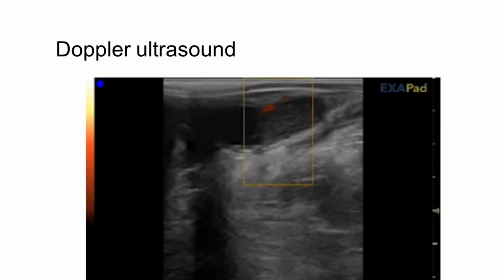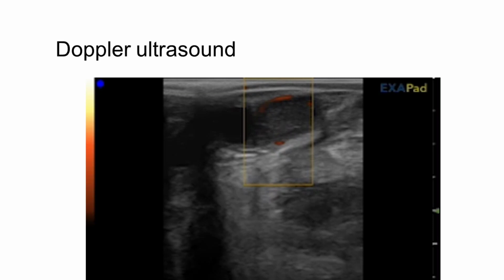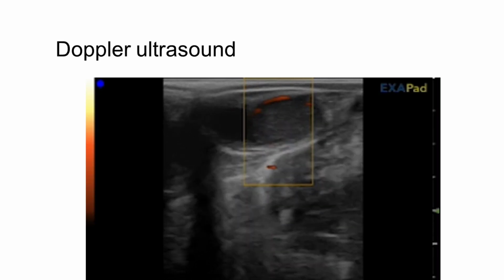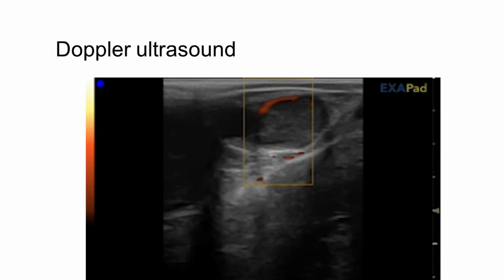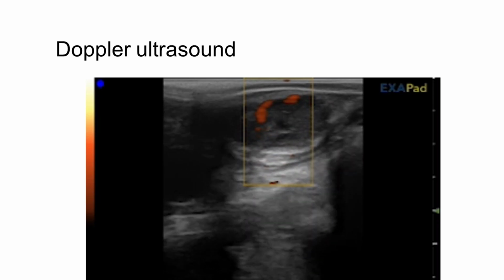You can see here the CL as well as the blood flow in a vessel. Note that the blood flow in vessels outside the CL are also visible. We will soon explain in details how to use the Doppler ultrasound and interpret its images.